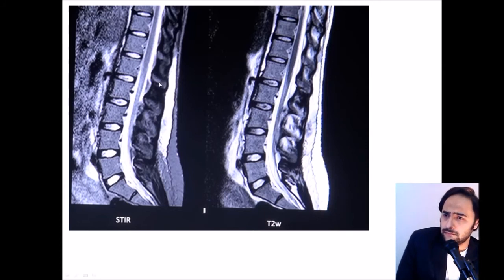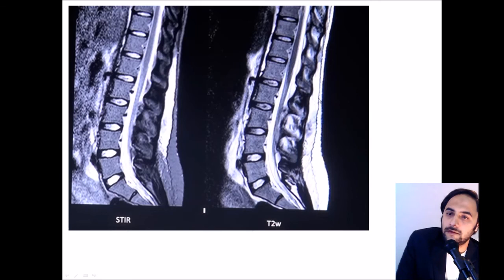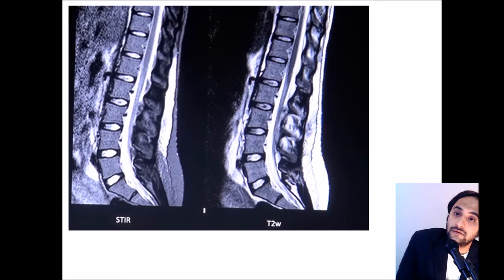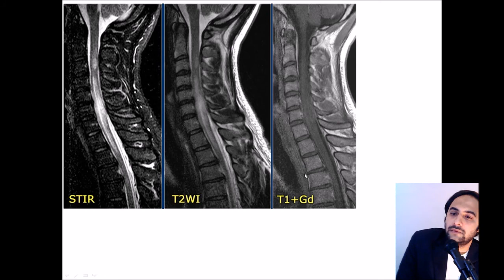Here is a lumbar region example: in the T2-weighted image there is suspicion of a pathology or inflammation surrounded by fat. After taking a STIR image, the fat is subtracted and the edematous tissue becomes visible. Comparing T1 and T2 — in T2 we cannot clearly differentiate where exactly the problem lies — whereas on the STIR sequence, the fat has been subtracted and the edema is clearly visible. In the T1 plus gadolinium contrast image, the CSF is dark; in T2 it would be white; in STIR, CSF is white but all fat has been removed.